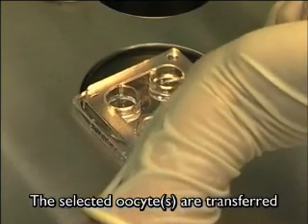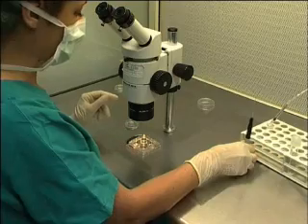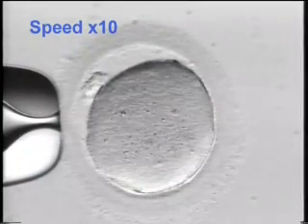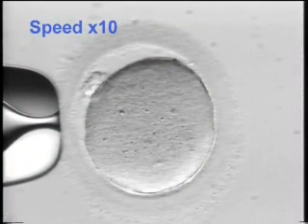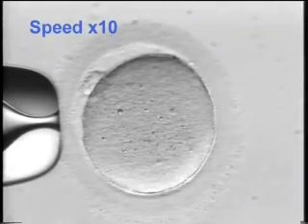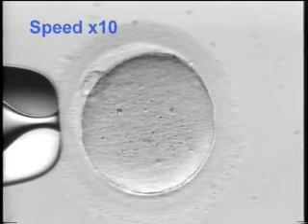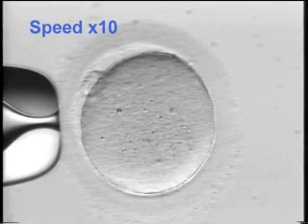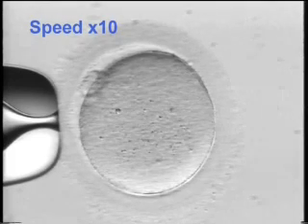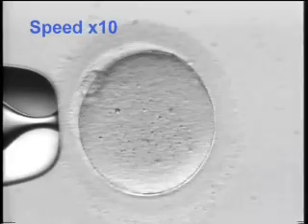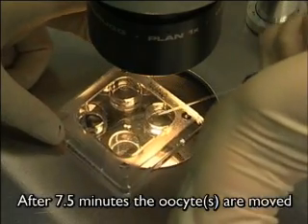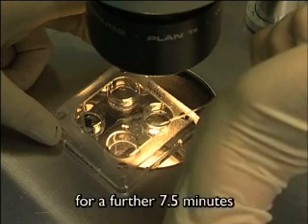The selected oocytes are transferred to freezing solution 1 for 7 and a half minutes. After 7 and a half minutes, the oocytes are moved by washing into freezing solution 2 for a further 7 and a half minutes.